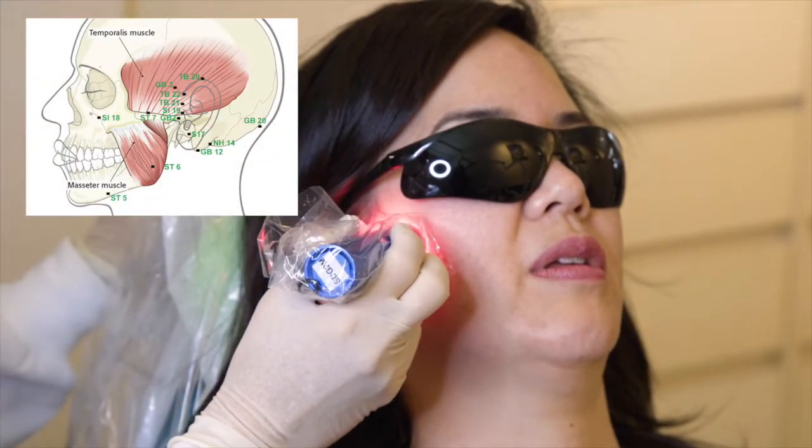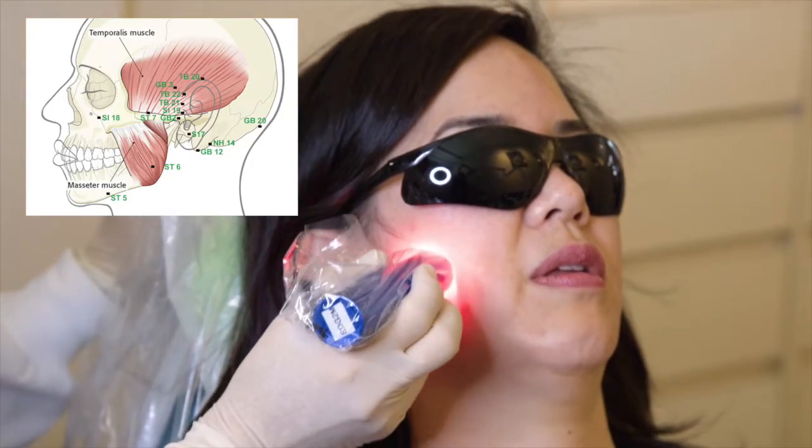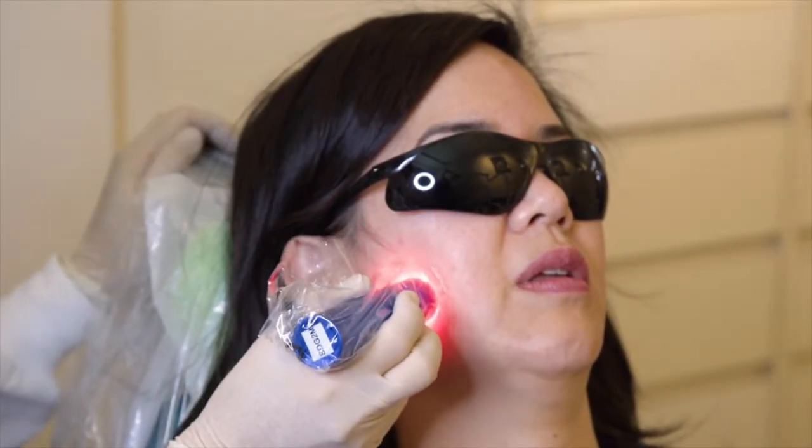The masseter muscle is this area — we will have them treat and that will be the whole treatment site, and that will complete the cycle.